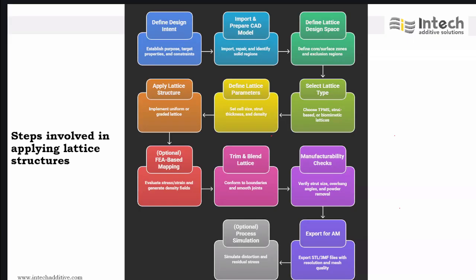And then now we have to define the lattice structure. So we need to implement a uniform or graded lattice structure. So in the theory, it's going to be uniform, right?